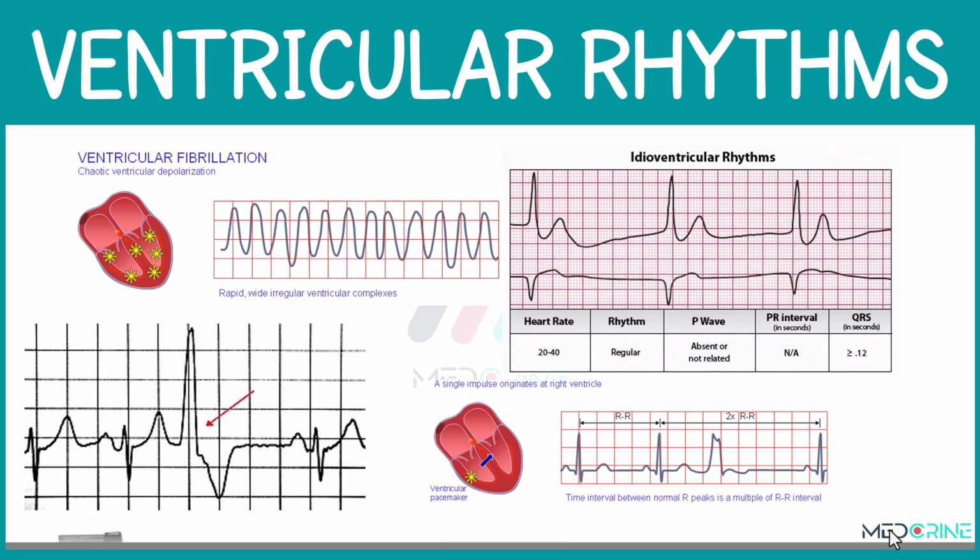Today we're going to look at ventricular rhythms. This is part of the cardiac electrophysiology lessons that we shall be looking at. And in this video, we shall break down the ventricular rhythms and how they appear on an electrocardiogram.